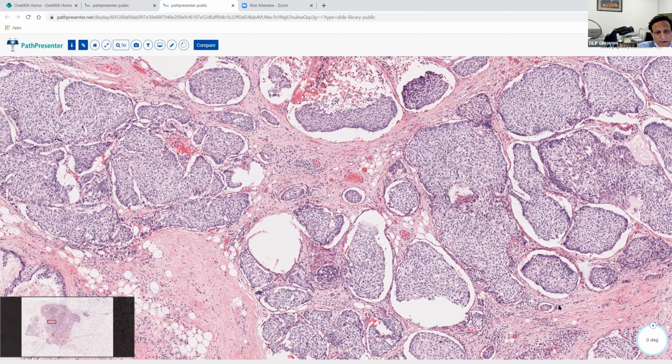So now over a wider space, these thinned out myoepithelial cells will be spread. You have to always think three-dimensionally, although we see only 2 dimensions on our sections. Any surgical pathology process has to be thought of as a 3-dimensional thing.